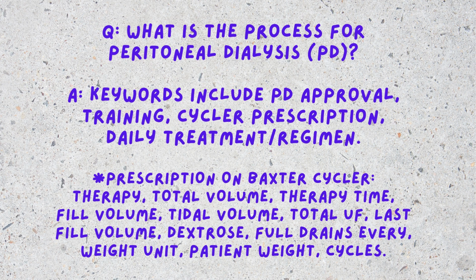And then when you go back on your machine at night, it would be the initial draining out some of those 1,000 ml. Now, of course, you won't have 1,000 ml on your initial drain, because some of that fluid also will be reabsorbed into your body. So for example, you have 1,000 ml, your initial drain could be like 750 or 700 or something like that.